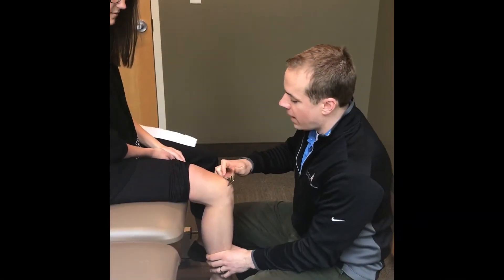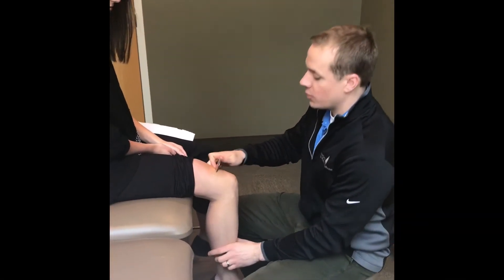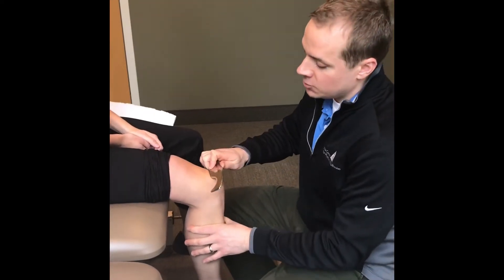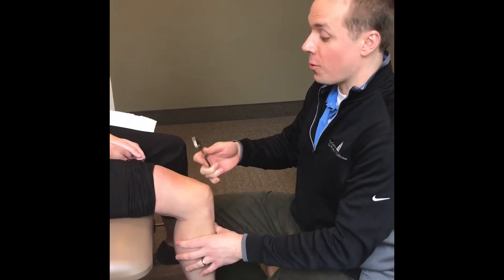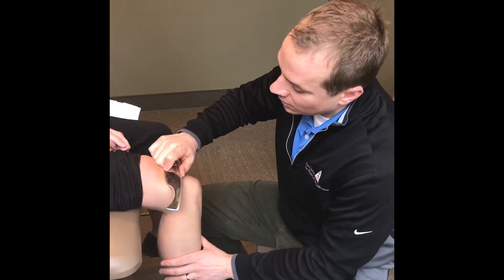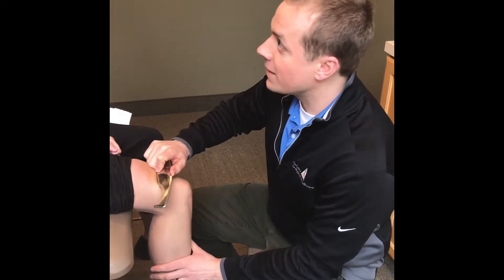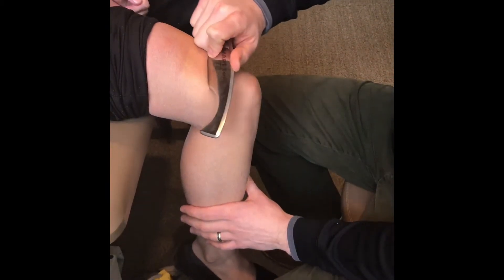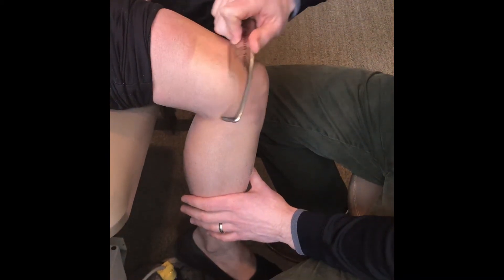Part of the theory behind using smart tools or instrument-assisted soft tissue mobilization is that it applies a unique stimulus into your muscles and muscle spindles, which is then sent to your brain, giving the nervous system almost a reset through these tissues.